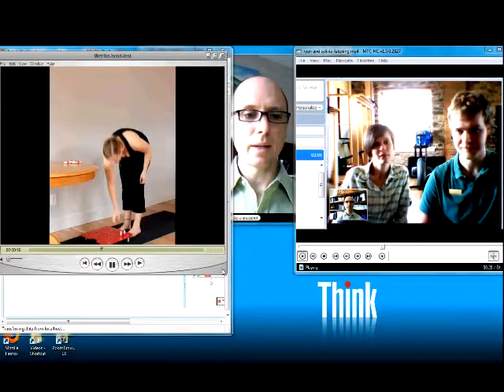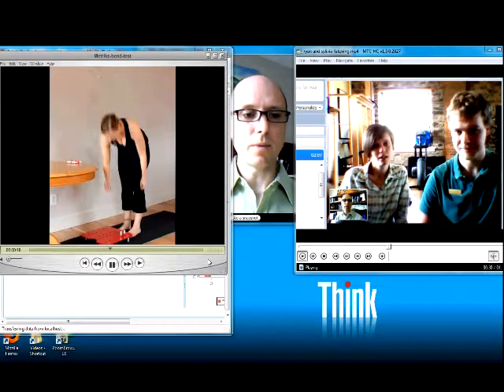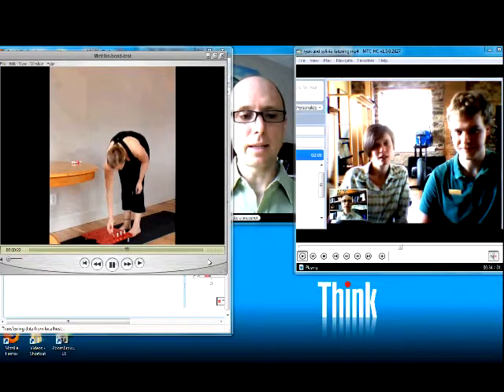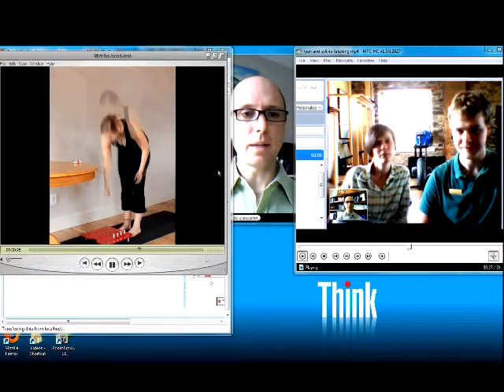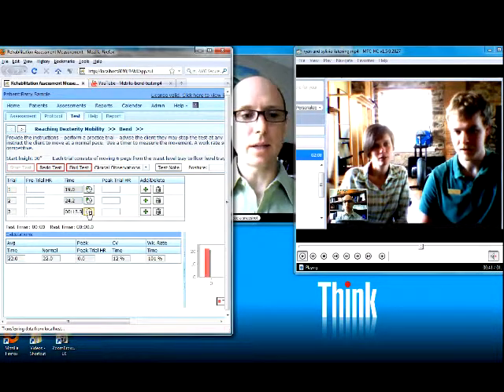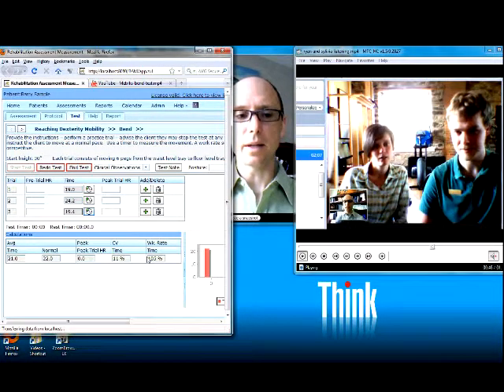We can watch the person going through. She's going to be moving the pegs from table height, or waist level, down into the pegs at the bottom. As she moves the final peg down inside there, we would hit the stop timer. The stop timer would then do the calculation of the score.